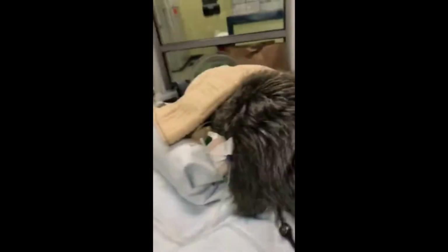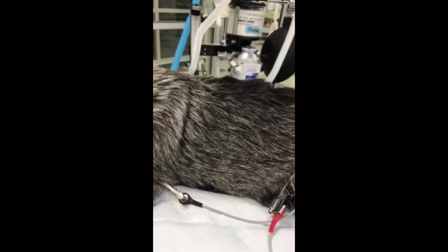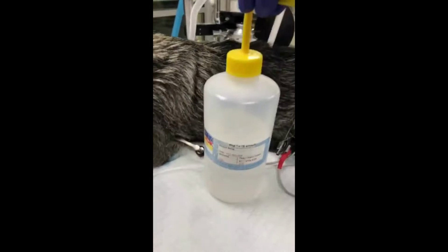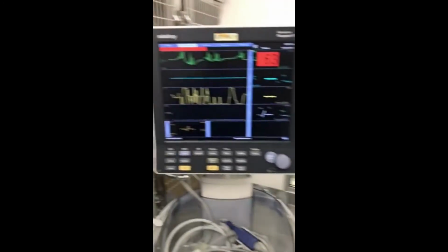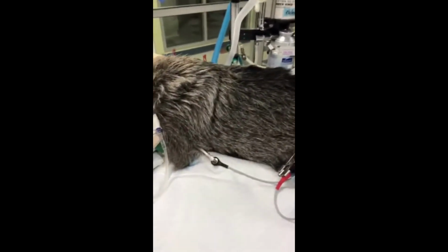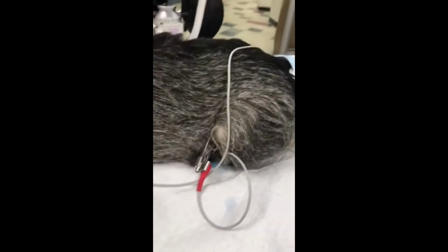We then need to place a conductive agent between the lead and the patient. You can either use electrode gel, ultrasound gel, or old-fashioned alcohol. This patient has been sedated with dexdomitor. So again, right forelimb, white lead, left forelimb, black lead, left hind limb, red lead.